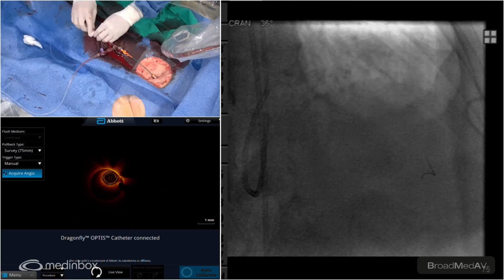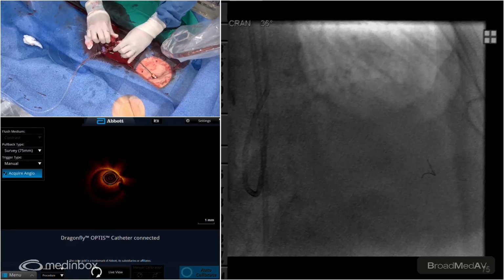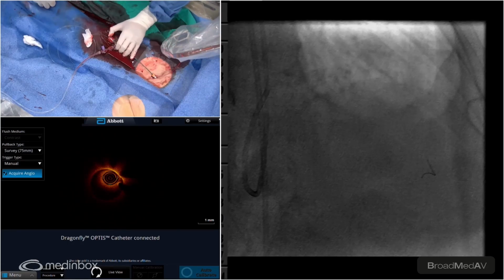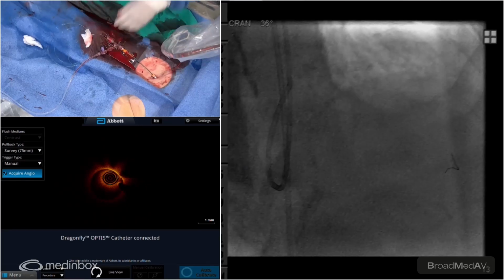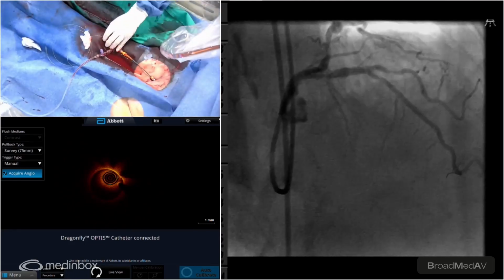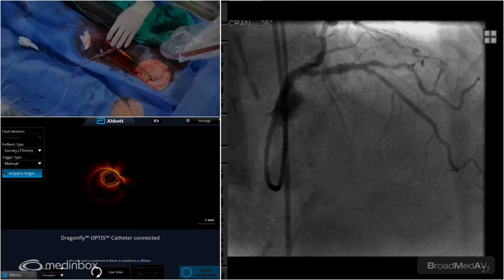Yes, please. Just pull it. What's that? Yeah. There you go. That's why I was saying that. Well, it helps with the blood pressure, I guess. You want this? It's okay. Let's hold off. It looks like it worked. I was just pulling it in too much. Let's do a little puff. Make sure we didn't cause any excitement there. That's actually pretty good. Yeah, it's good for the OCT for sure.